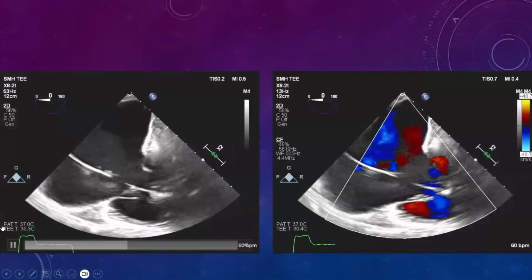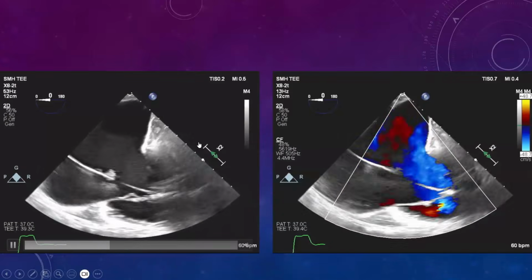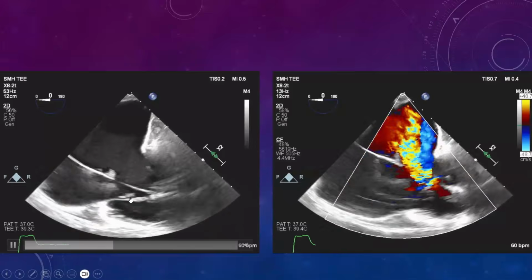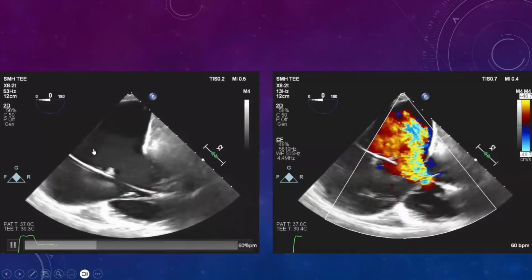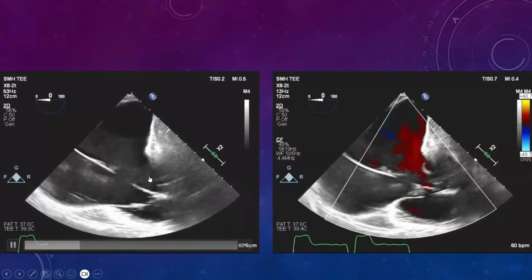We're going to put aside this little part here that is not part of the discussion point right now, but to note that we didn't just ignore that in this patient. But we do have a wire here, and the atria are quite big. There may actually be a little bit of prolapse here as well. So this is probably multiple mechanisms. There's definitely some prolapse here, but that's not the entire component of what's going on.